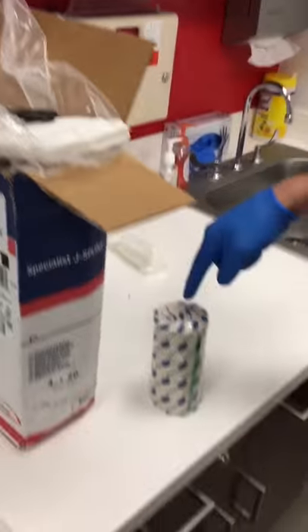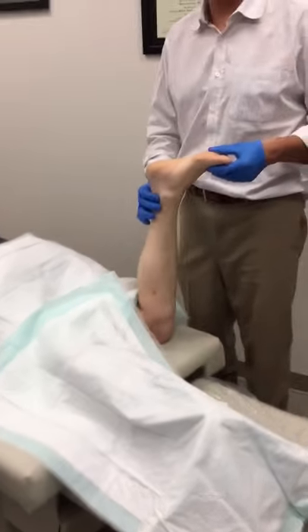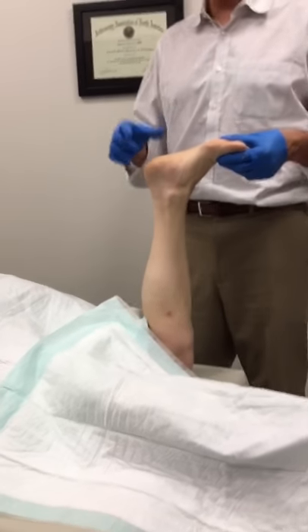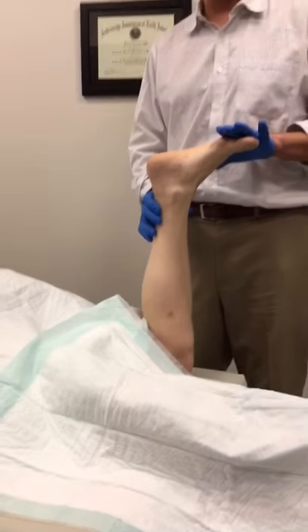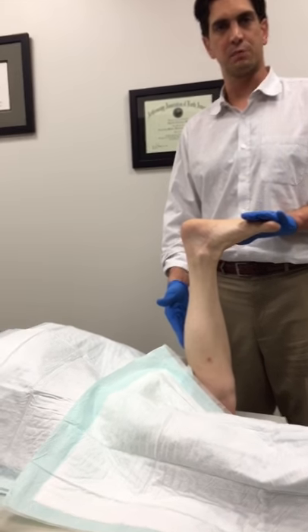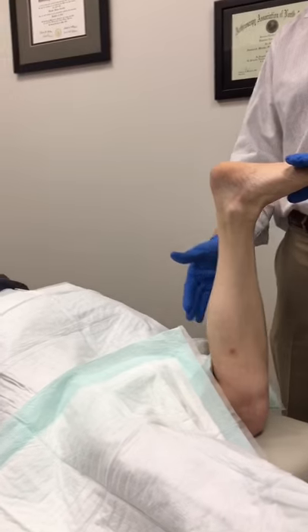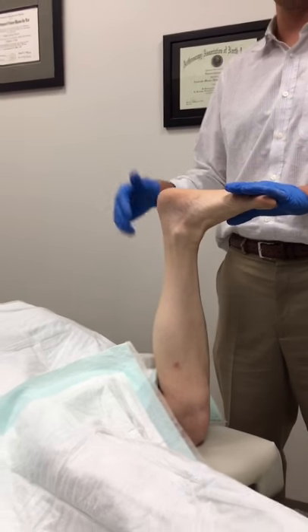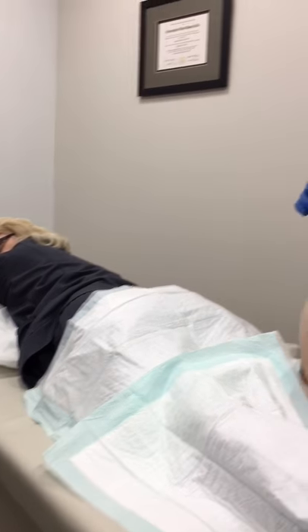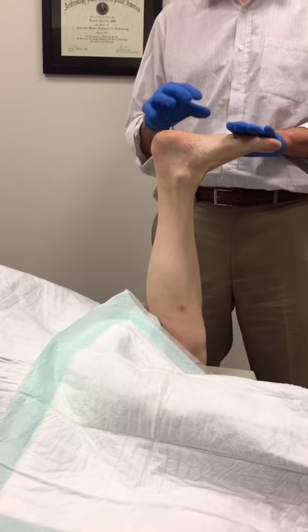And then the last layer is a 6 inch double ace wrap. We have our patient who is in the prone position, in this case in the office setting. Oftentimes the prone position is helpful because it's easier to put the ankle into a neutral position when the knee is bent. The gastrocnemius is put at rest with the knee bent, and therefore the prone position is easier than the supine position to have optimal positioning of the foot.